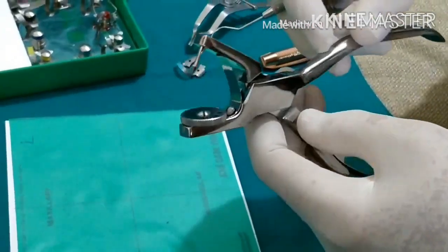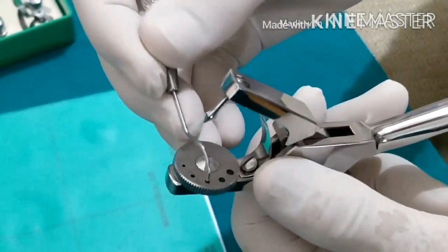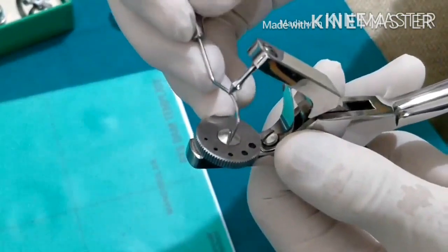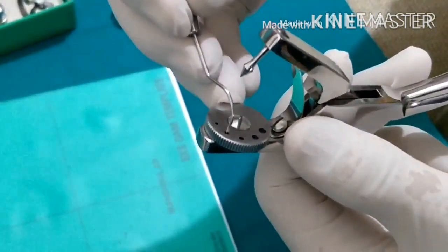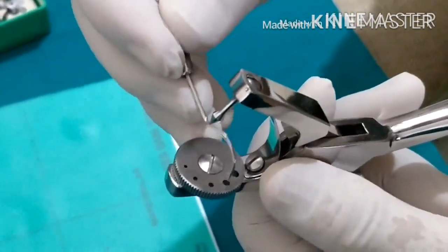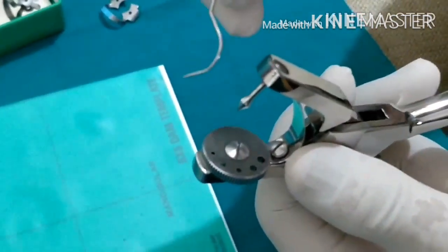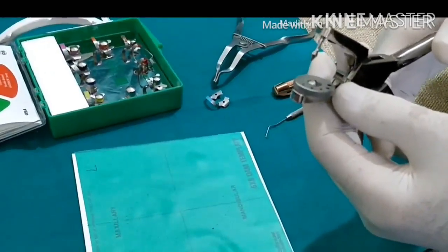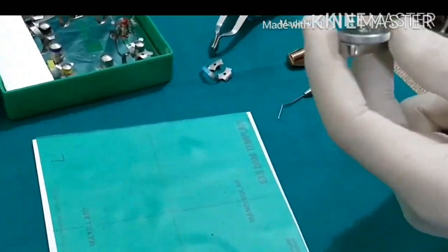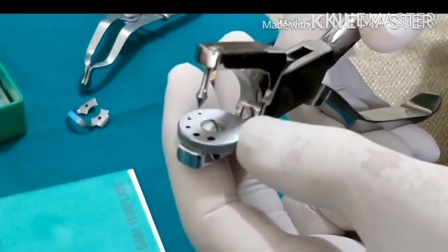This is the rubber dam punch. The punch has five holes of different sizes. When you are regularly using it, some of the tags that have been punched remain inside the hole, so you must clean it out so that the hole is free and you get a clean, good punch.